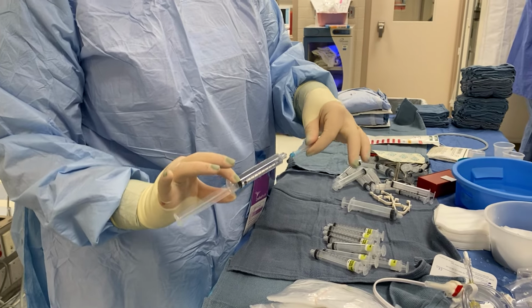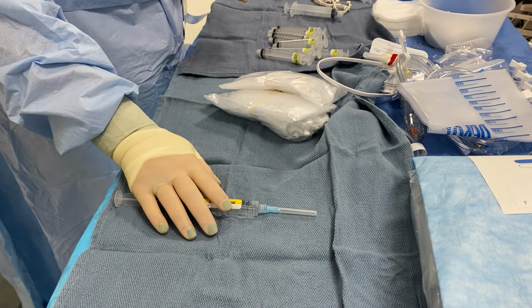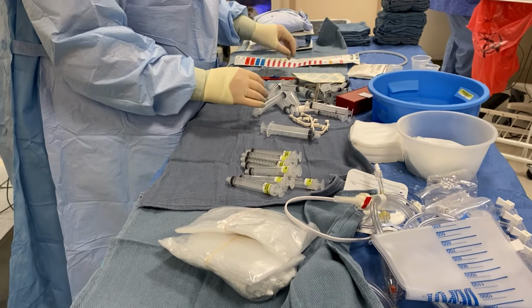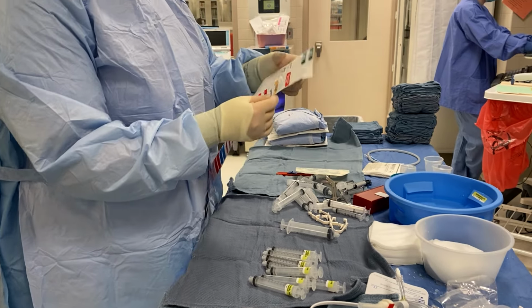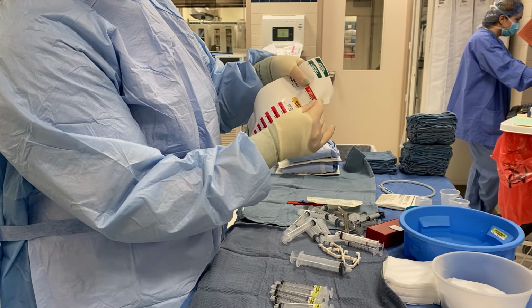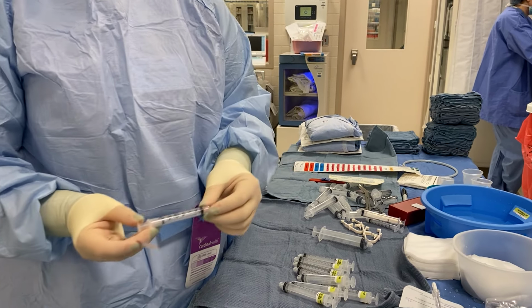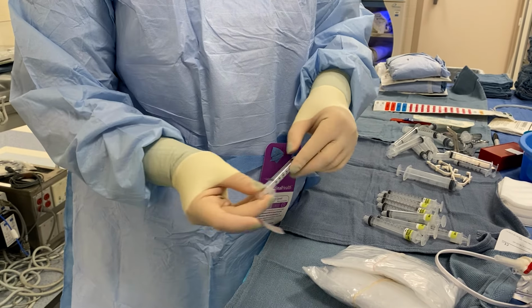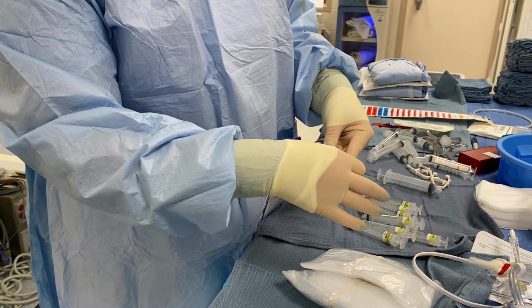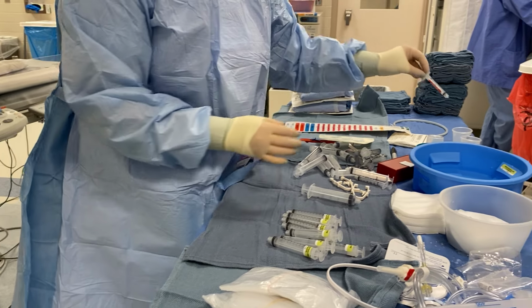And I have my 25 gauge needle that I'll twist right on, and I'm gonna set it right here because this is where the doctor is gonna look for it. The next thing that I'm gonna label is a nitroglycerin syringe. And with nitroglycerin, we wanna be able to use a small syringe. So I have a 3 cc syringe here, and I'll just put the label on this way. And I'm just gonna put that right into our cup here.